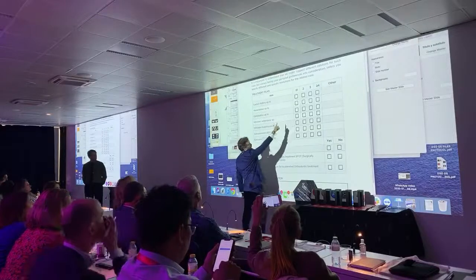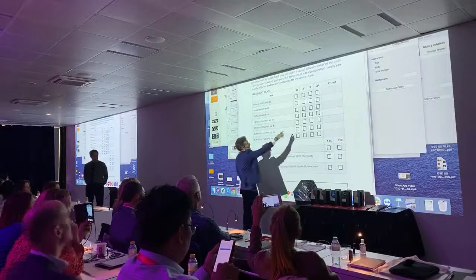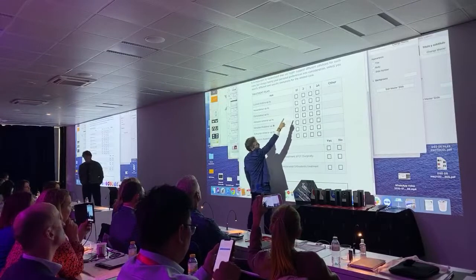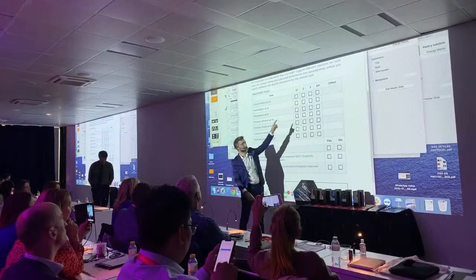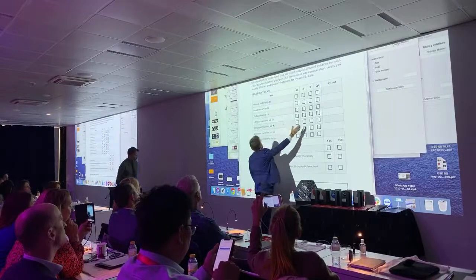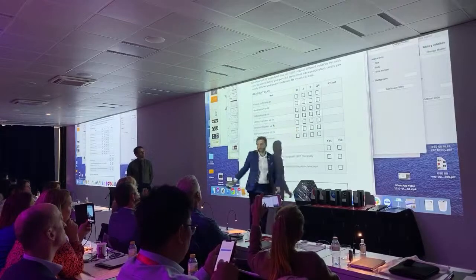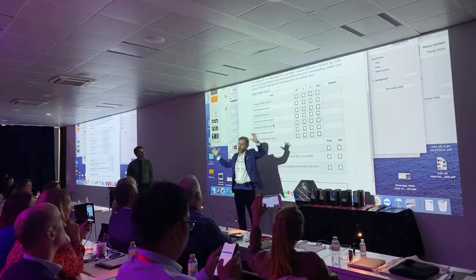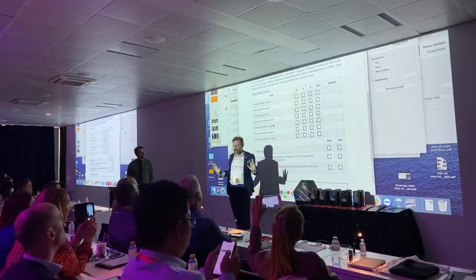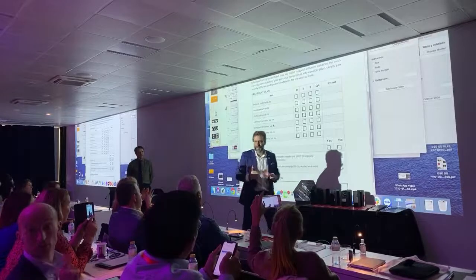So you're putting your limitations here, your orthodontist limitations. Okay, so if you put 1 millimeter there, we're never going to suggest on the design a correction of 3 millimeters. But maybe a doctor uses SFOT or whatever, so he can do anterior extrusion or intrusion, posterior intrusion up to 4 millimeters. How can I do that? I don't know. He's telling me he can do it. I'm not the one to judge. Is this for each case? Yes, okay? Each case is up to communication.